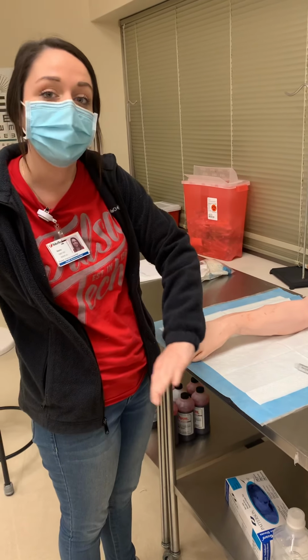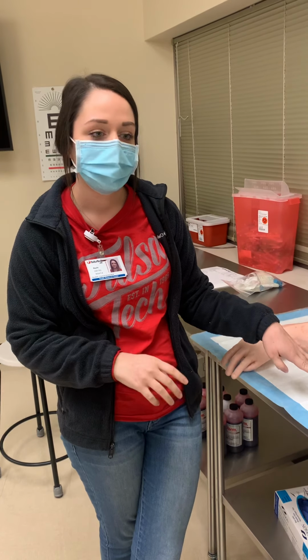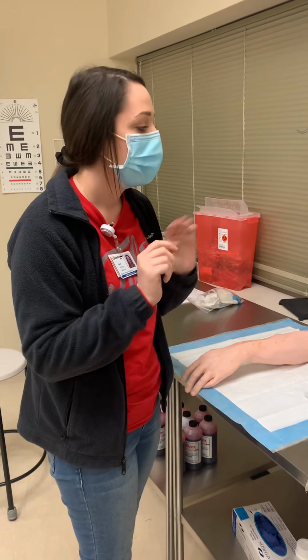This is my IV insertion video. So I'm going to start by checking the MAR and the record and the order for an IV. I'm going to gather my supplies, knock on the door, provide privacy, wash my hands, introduce myself to the patient.